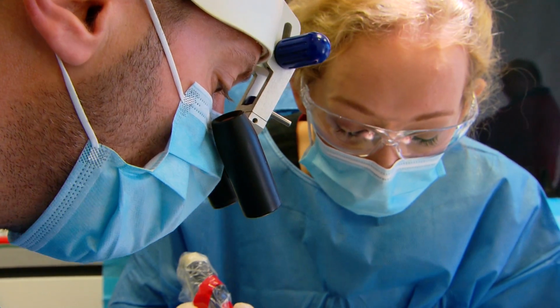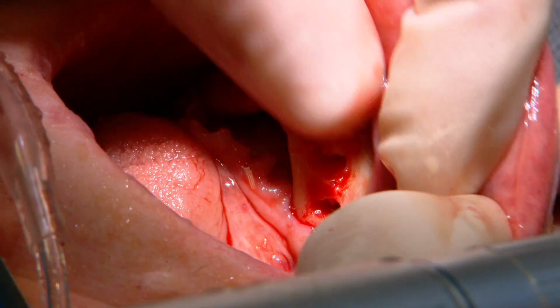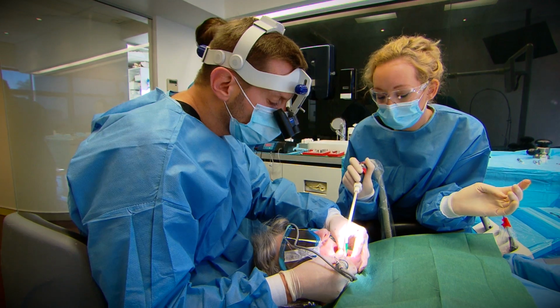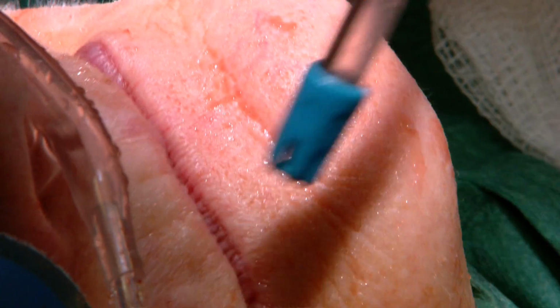What's important now is we make sure we feel the bone and make sure there's no sharp edges that can hurt the gum above it or actually cause a problem underneath our bridge. Okay, the alveolectomy is done.